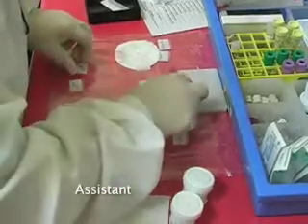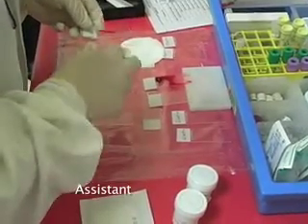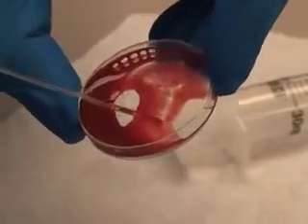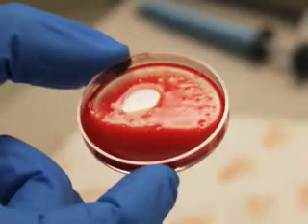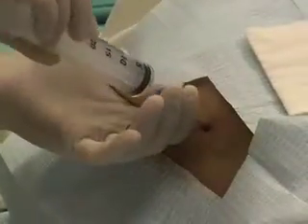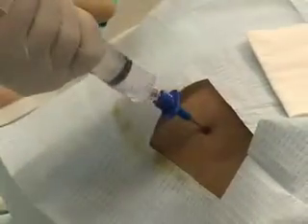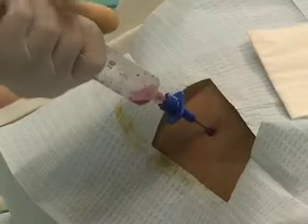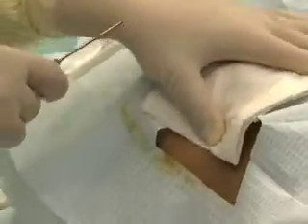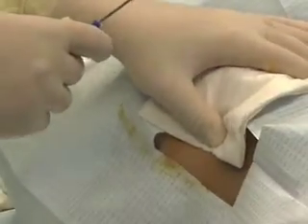The non-heparinized aspirate should be used to prepare specimen slides. Adequacy of the specimen can be verified by the presence of bony spicules in the sample. Next, aspirate marrow into syringes containing 1 milliliter heparin as needed for diagnostic tests. Remove the aspiration needle and apply pressure with sterile gauze until you are ready to perform the biopsy.